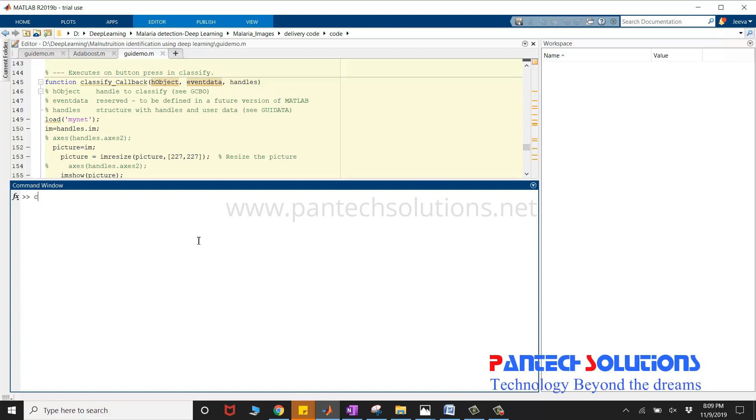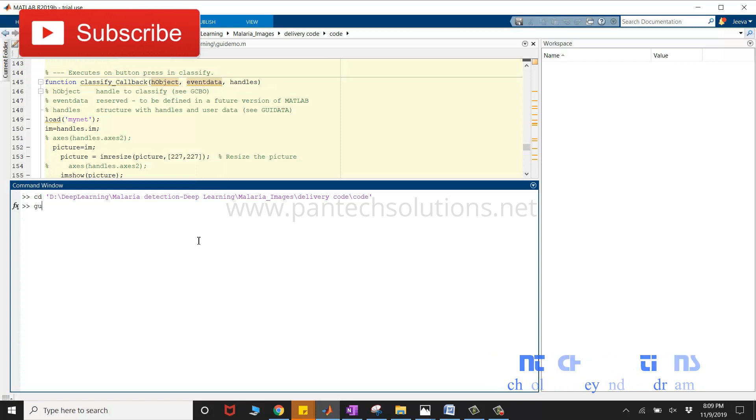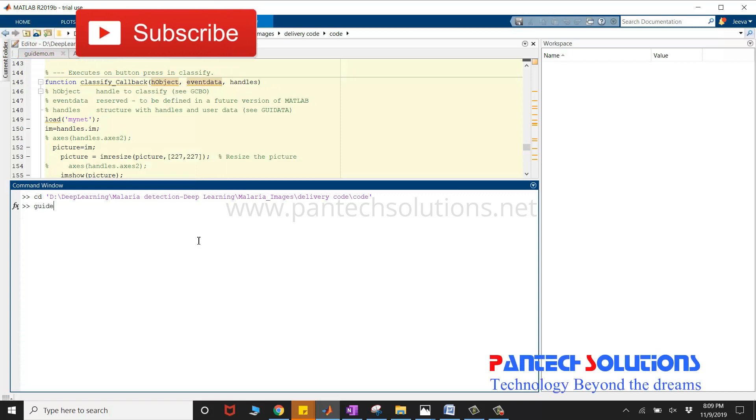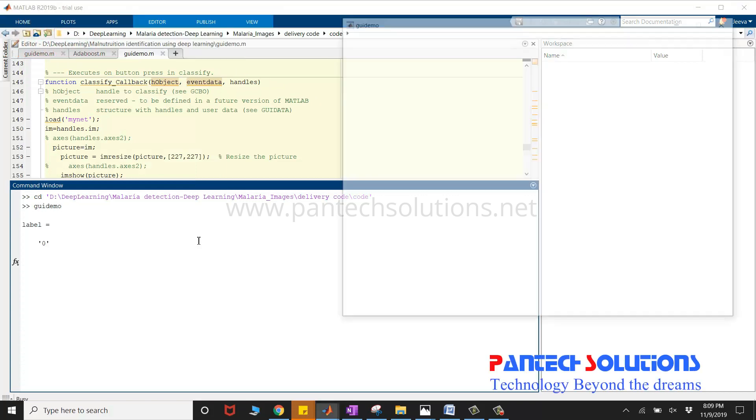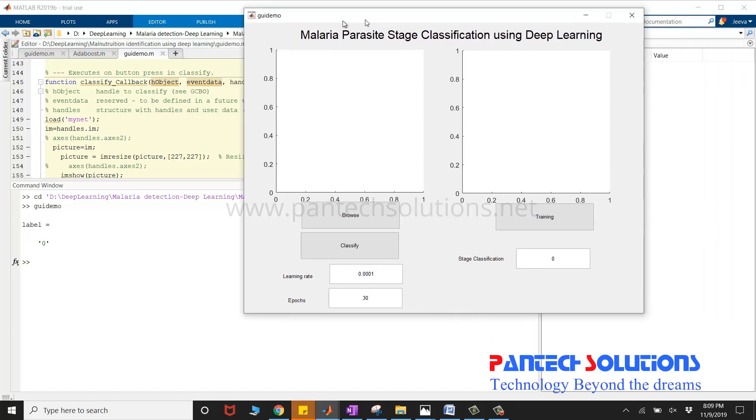Open MATLAB, change the path, and run the main program. GUI demo is the main file. Once you run the main program, it opens the graphical user interface.